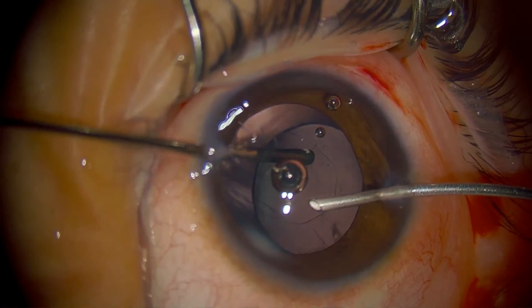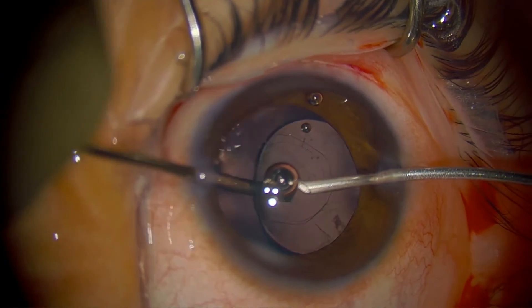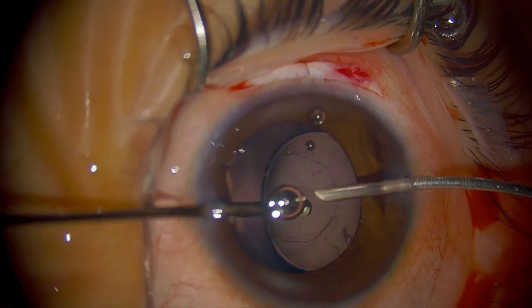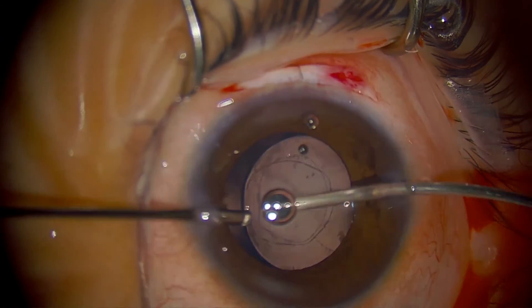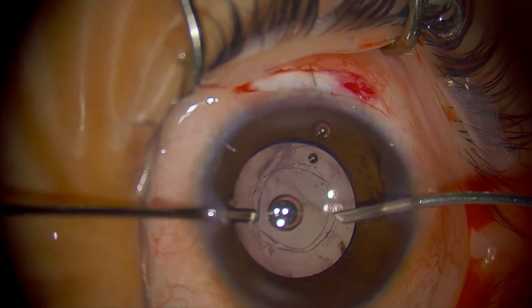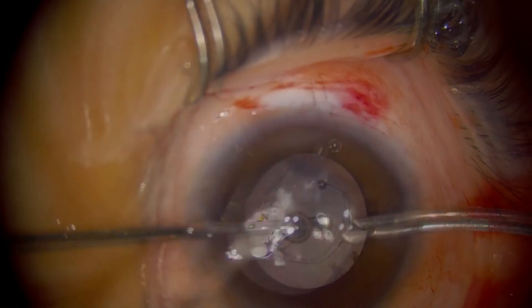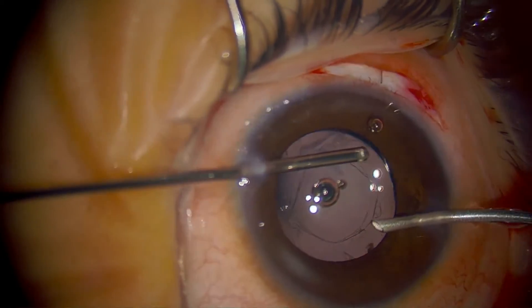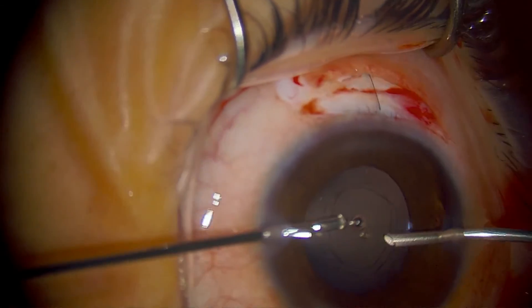I like it around four millimeters. Then I'm going to go deeper in there and do a core vitrectomy to break the anterior hyaloid. So now we have an anterior capsulotomy and a posterior capsulotomy — that's all done. Now I'm going to take out the viscoelastic from the front. If I see any vitreous coming in front, I can turn it back to cutter — like right now.